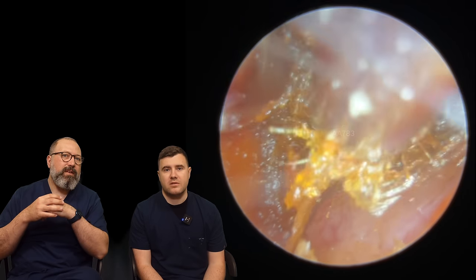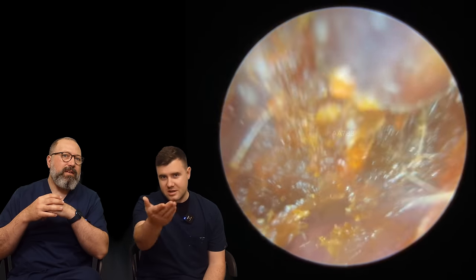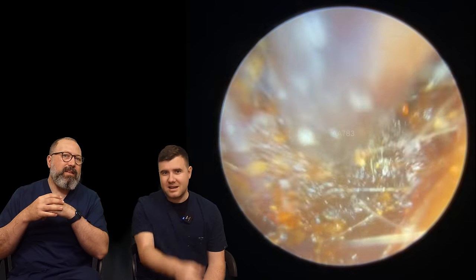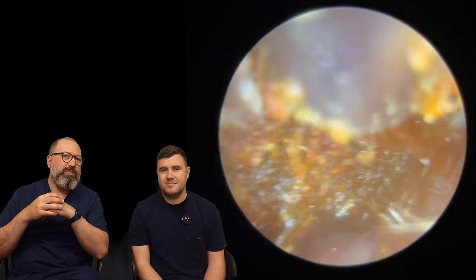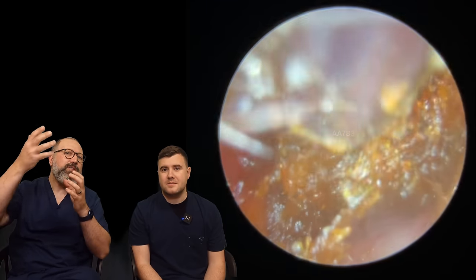Yeah, just going to say we're starting to get some movement already — you can see it just starting to peel that dead skin layer away as well on the outside edge. Forward momentum though, isn't it — when you hold on to it, everything's starting to come towards the camera, towards that lateral portion of the ear canal.